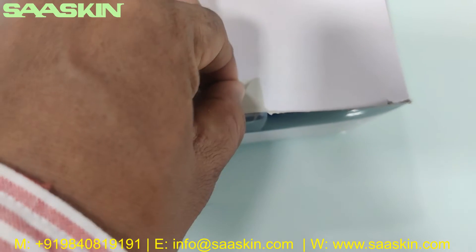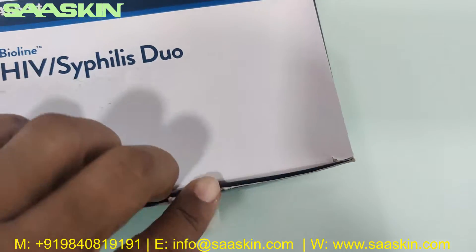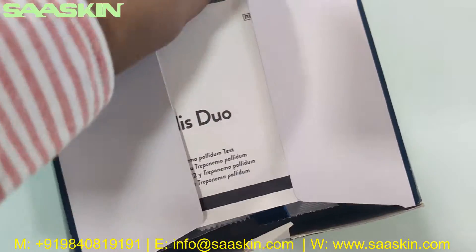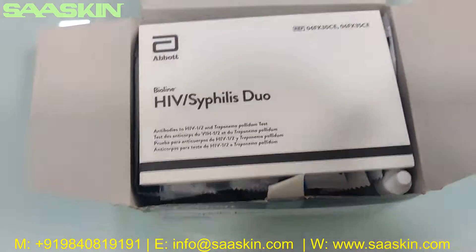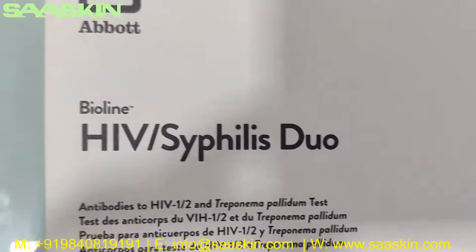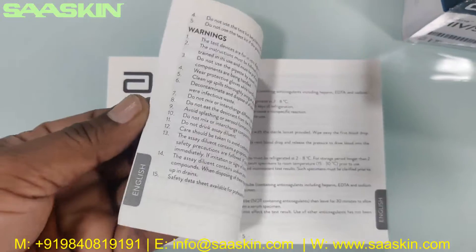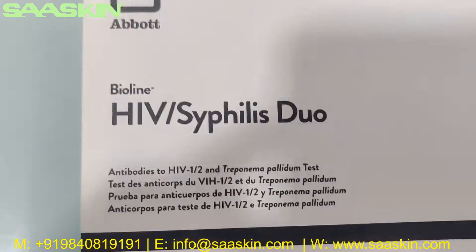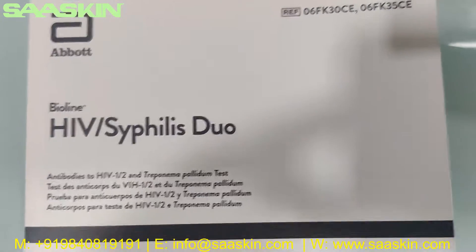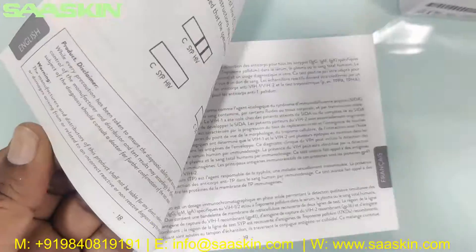I'm going to open this box for you now. Inside the box you get a booklet with complete instructions for conducting the test — it covers how to prepare the test, how to conduct the test, and how to interpret the results. This is the complete instruction booklet for the Abbott Bioline HIV Syphilis Duo Test Kit.